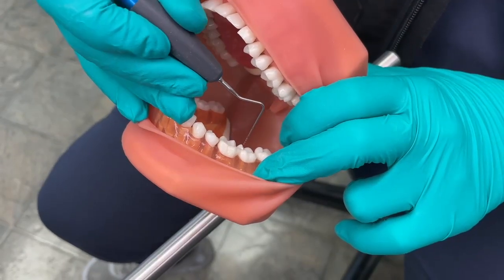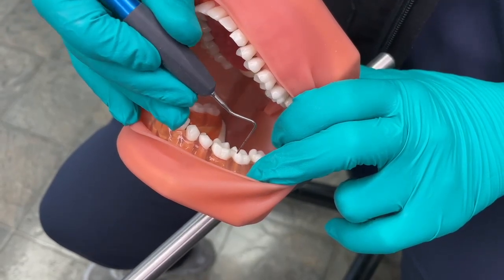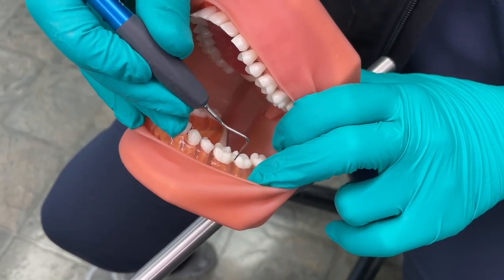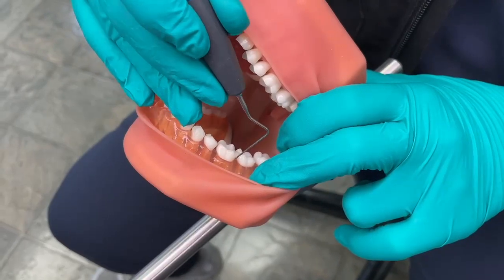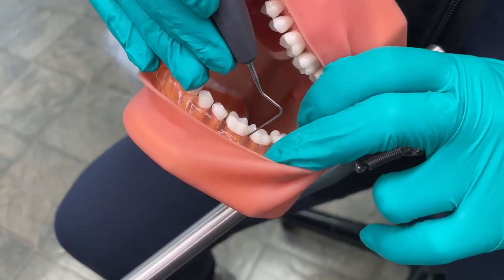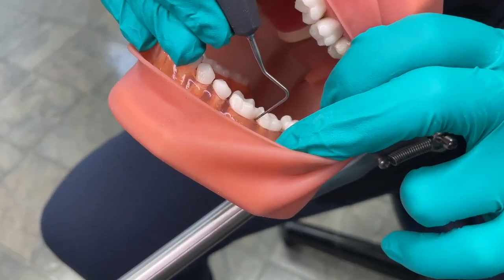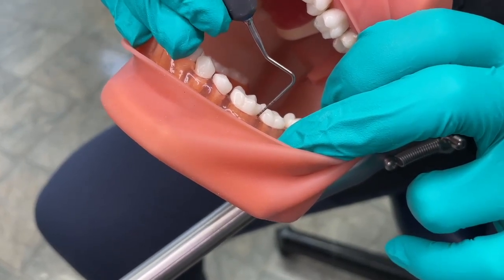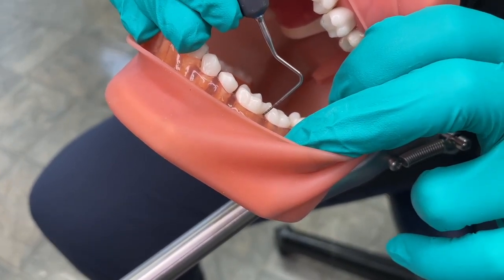Let's talk about how to find interproximal clinical attachment loss. What you do is take your probe depth interproximally and read your number — we're going to put it at a number five right there.